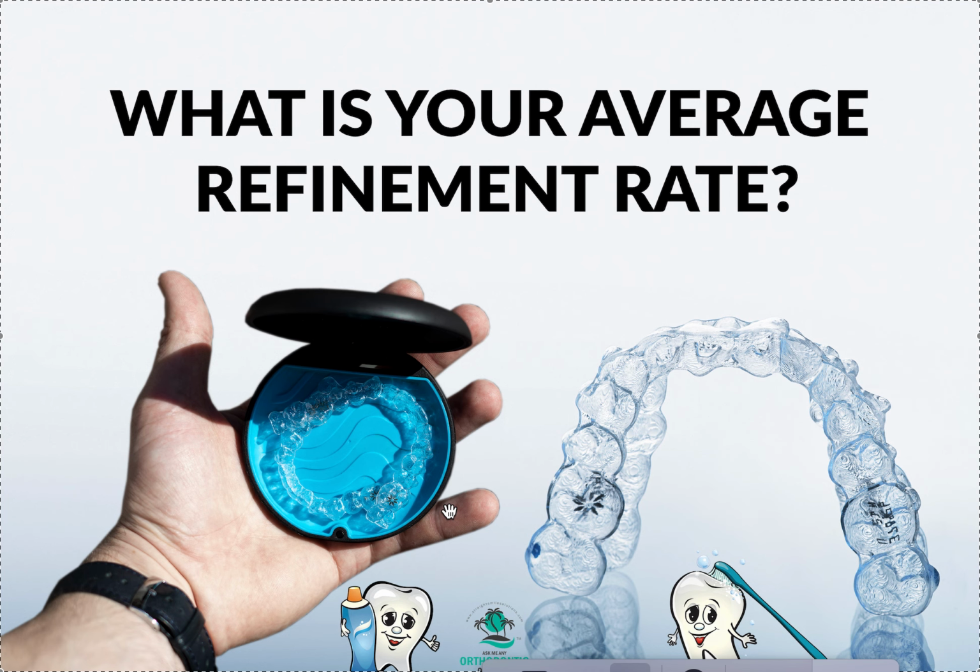First thing you have to do is idealize your treatment plan. Make sure it's a predictable treatment plan that can actually happen. Second thing you need to do is slow down your aligners. I always recommend that you double all your ClinChecks. So once you get it right, if they tell you it's 25, it's now a 50, okay? Bare minimum, maybe even 2.5.